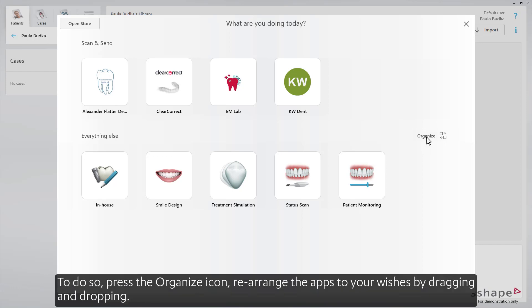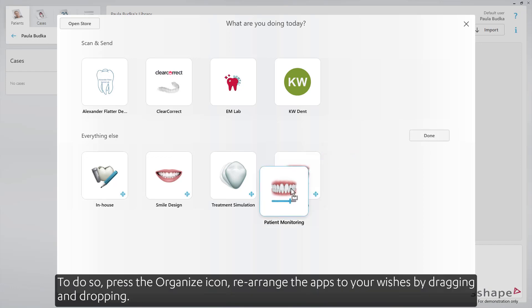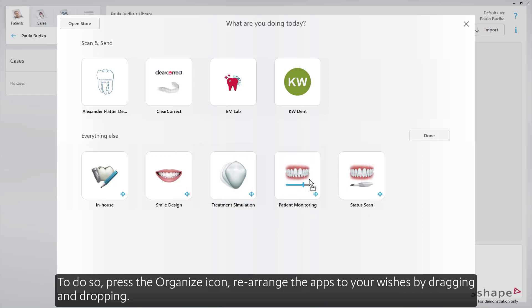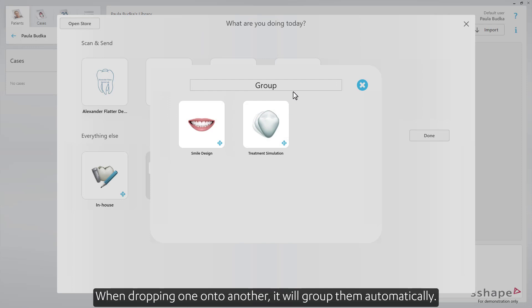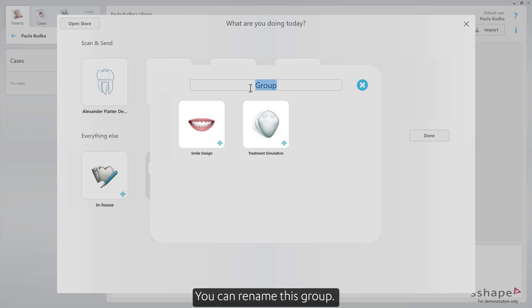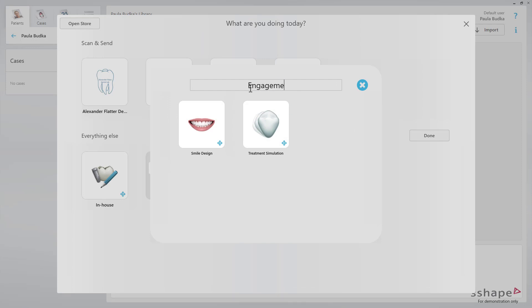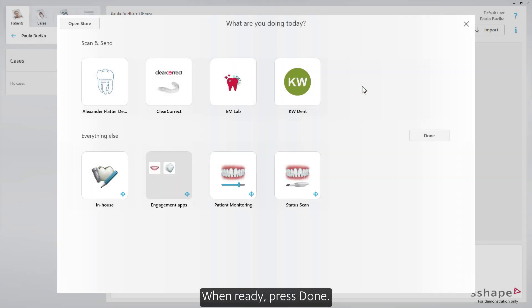To do so, press the organize icon. Rearrange the apps as you wish by dragging and dropping. When dropping one onto another, it will group them automatically. You can rename this group. When ready, press Done.